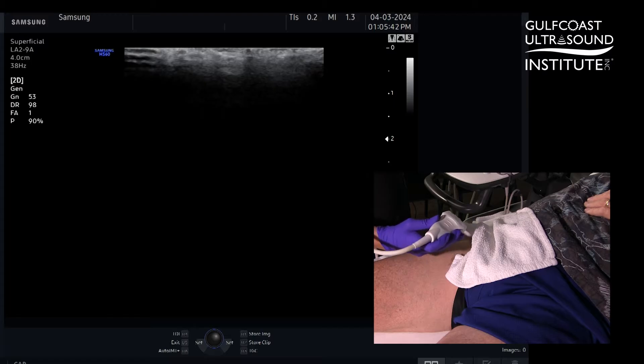This plane block is performed with a linear probe. Its indications are for femoral fractures as well as hip fractures. It's used for multimodal pain control.